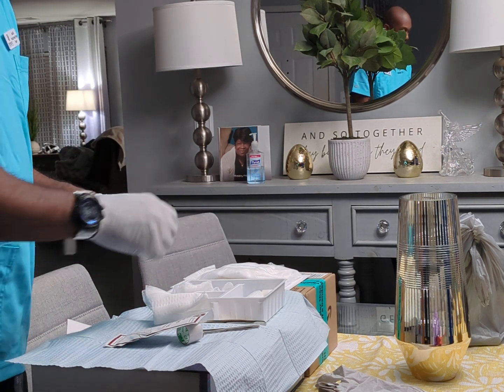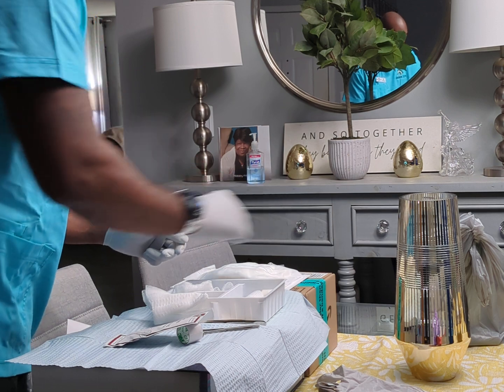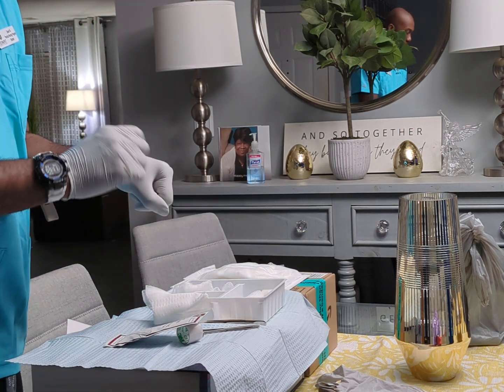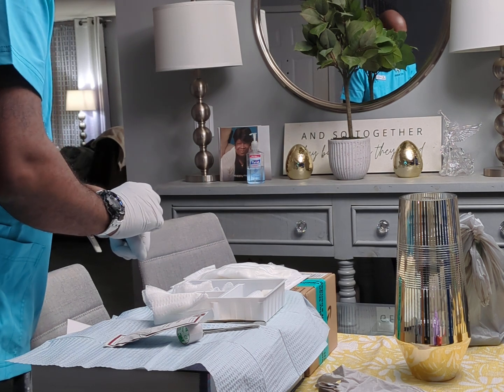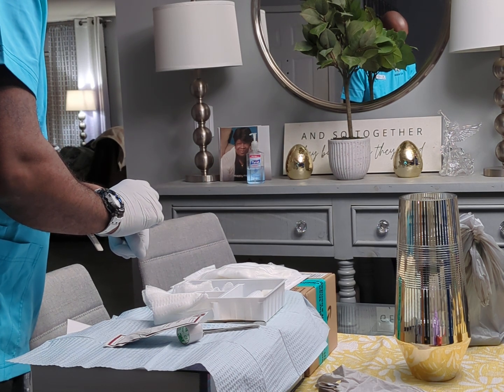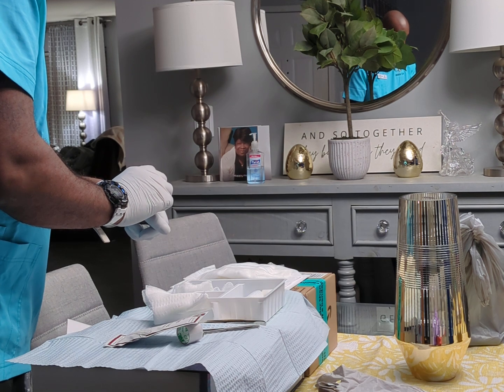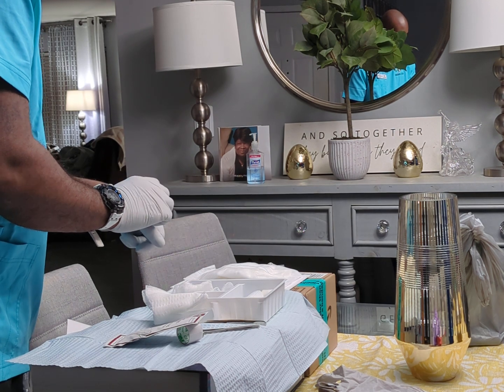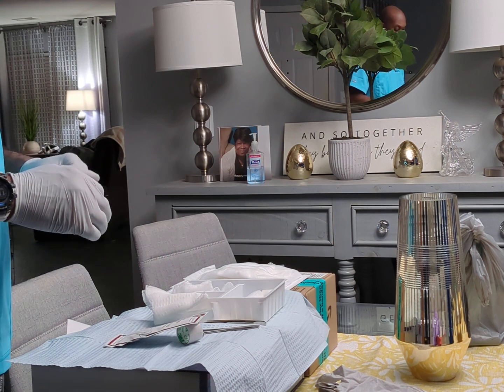Then I would take my tape on the sides, one, two, three, four, and take another piece of tape, write my date, time, and initials on it, and put it on there. Technically, after that, I will be done.